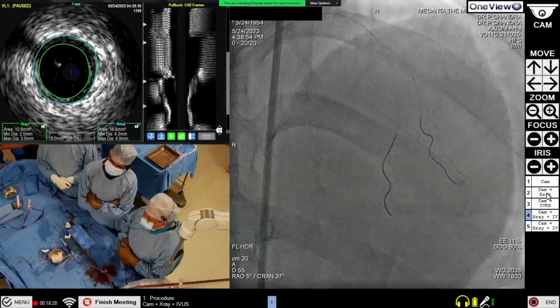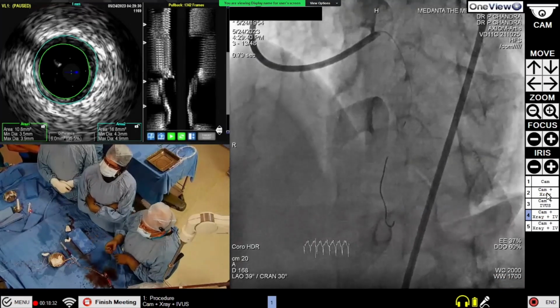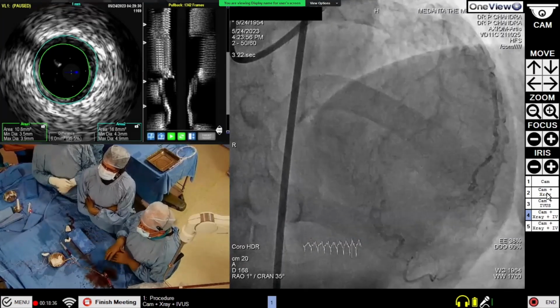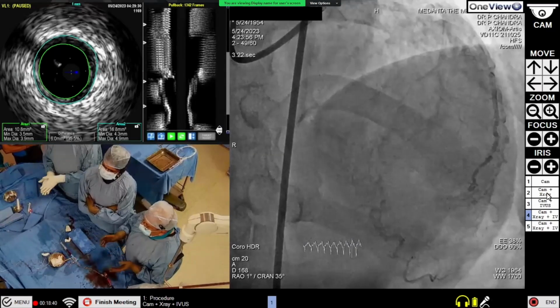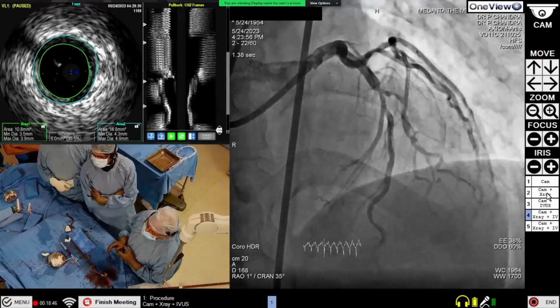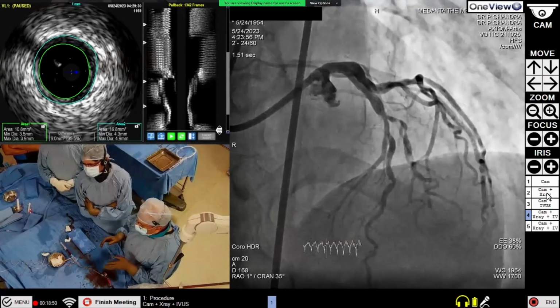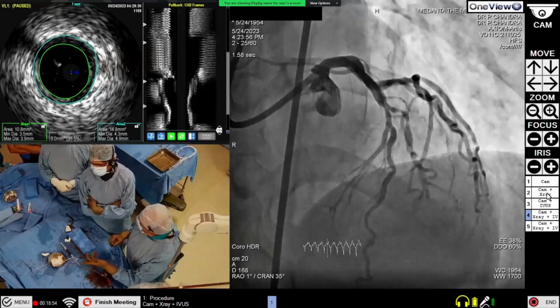The second is that this diagonal can also get affected. Then we have to put a second stent. So which means we are saying that if we go this way with a stent in the main vessel to LAD, then we will have to be ready with a second stent also. So that is why we thought that in case we are able to shock it, the plan is now to shock wave the LAD.